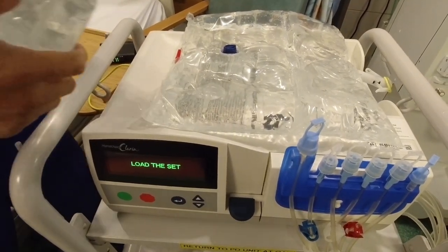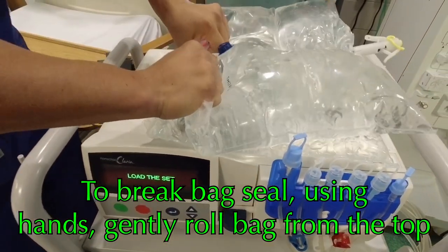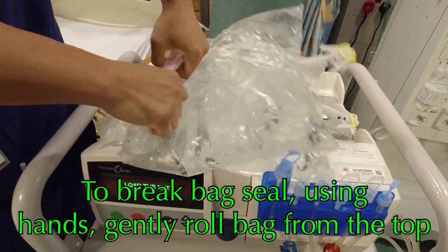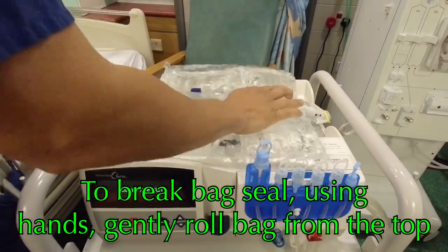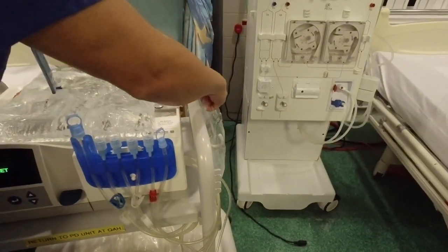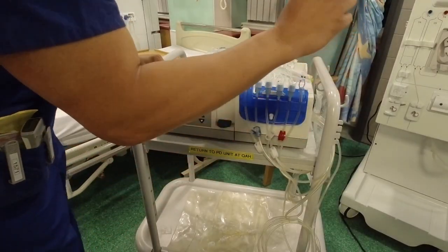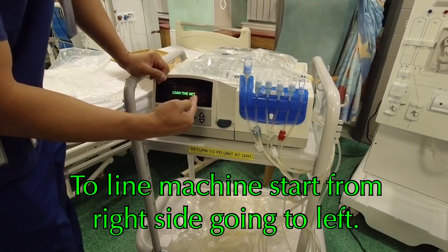Another bag. Same thing again, same procedure. Just gently roll it from here. And then, you know. Alright. So one bag stays on the warmer and the other one goes to the side of the machine. Okay, now the way to work this out is you start from right side to left.